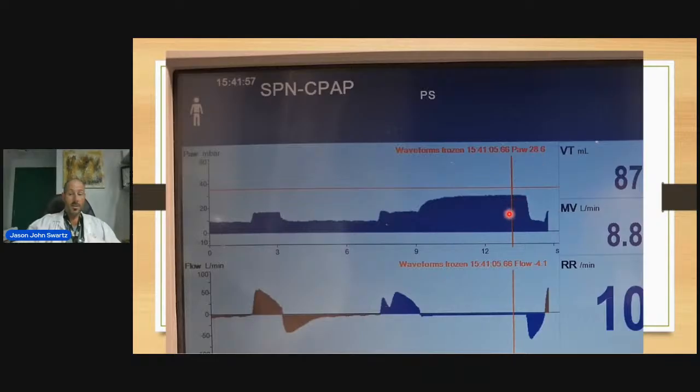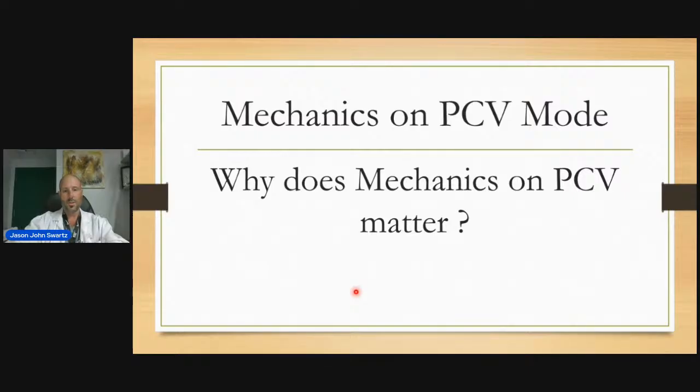And again, you look at the patient: are they struggling? You can see that the patient is not struggling just by the nice, normal inspiratory flow waveform. So that's just to show you that it applies as well for spontaneous breathing patients.